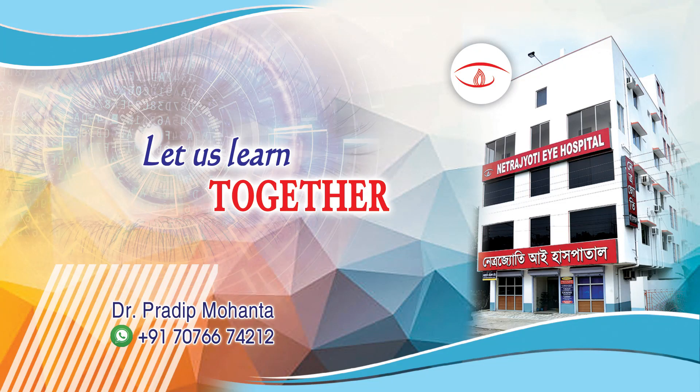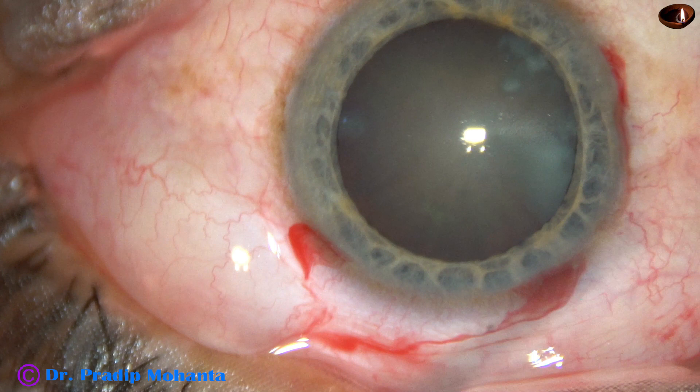Friends, welcome to my workplace at Ranaghat, West Bengal, India. This is a cataract with grade 3 nuclear sclerosis. The pupil has dilated quite well.